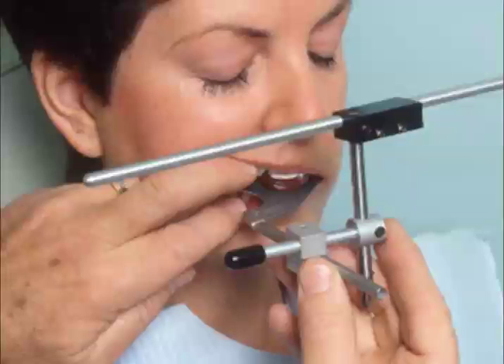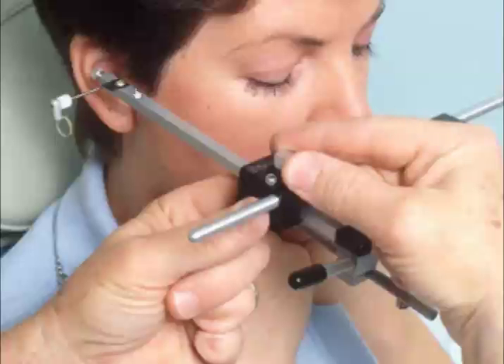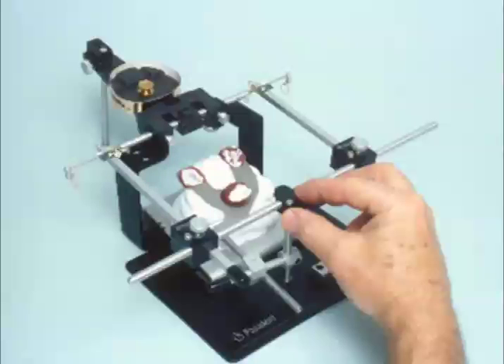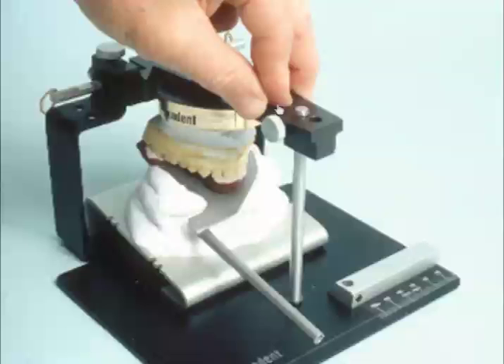So then we come back with a face bow. We can add a crossbar and clamp here so we can add back the recording arms to come back to that spot we marked on the skin so that we can transfer that true hinge axis of the patient over to the true hinge axis of the articulator when we mount the cast to the true hinge axis.